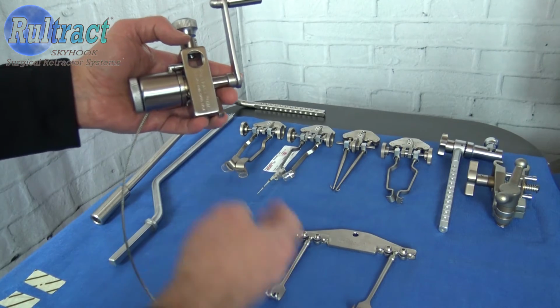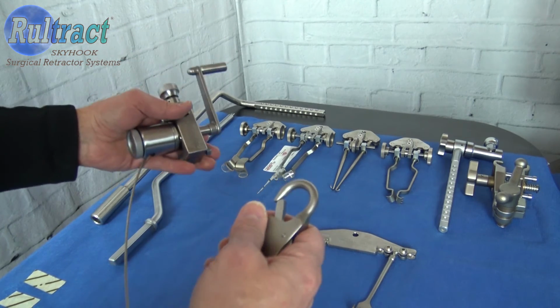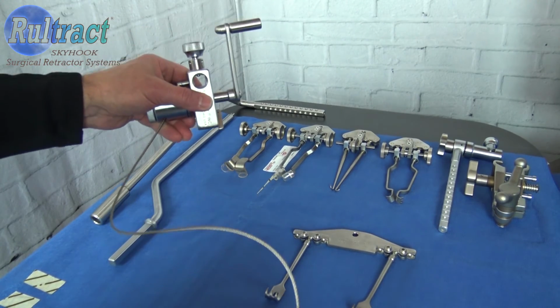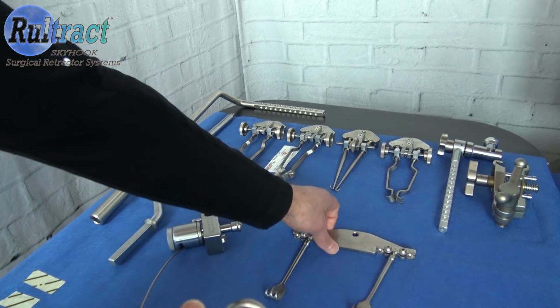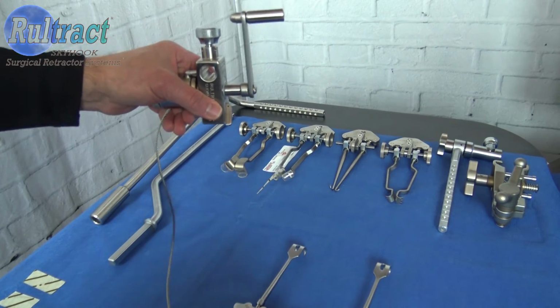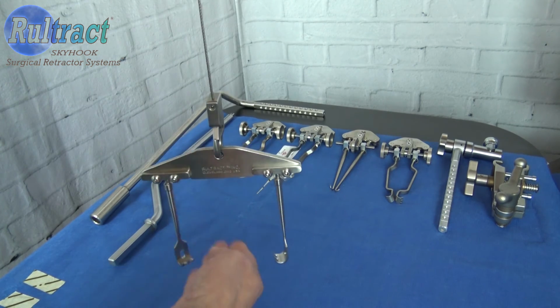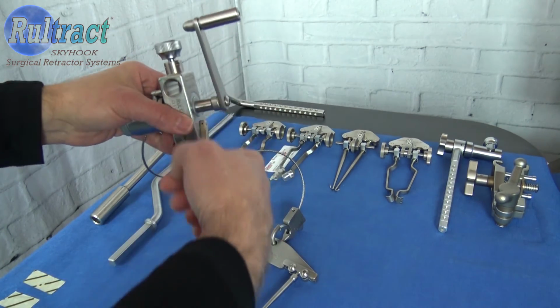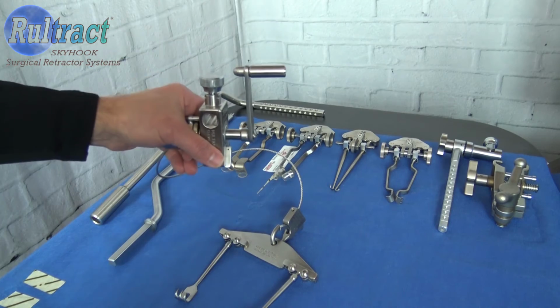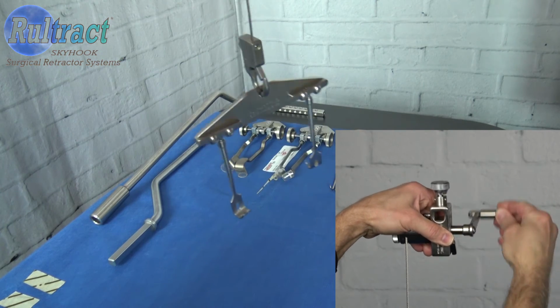Now, in order to properly wind your cable into the spool, you should attach your rake plate or one of your resternotomy retractors to the snap clip. When there's weight hanging off the snap clip, it allows the cable to wind uniformly in the spool. But the key here is to not only attach one of the rake plates, but also to be sure that you hold your ratchet assembly high enough in the air so that the rake plate is suspended off of the table. You don't want to have the rake plate sitting on the table and then wind your cable into the spool, because the cable will kink in the spool. So attach your rake plate to the snap clip, hold your ratchet assembly up, and then wind the cable into the spool.